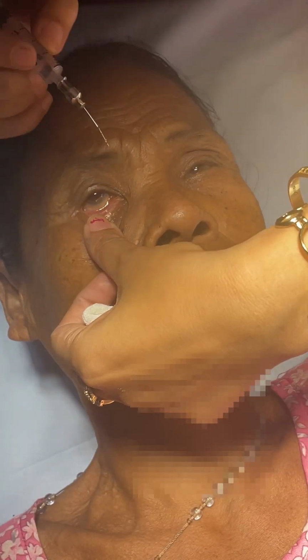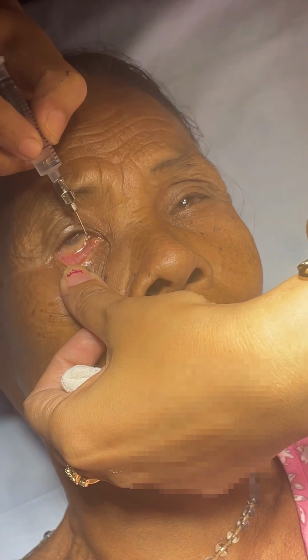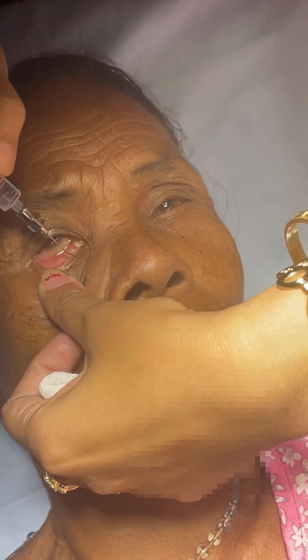Now before doing the procedure, we have given the topical anesthesia. Now we will dilate. This is too small, and I think we can do it like that only. I am doing it to the inferior punctum, but actually we should do it from the superior punctum. Now we will see how the fluid comes out.